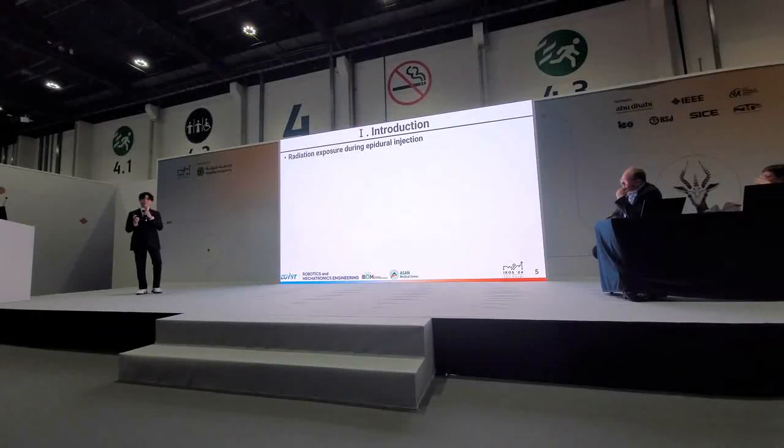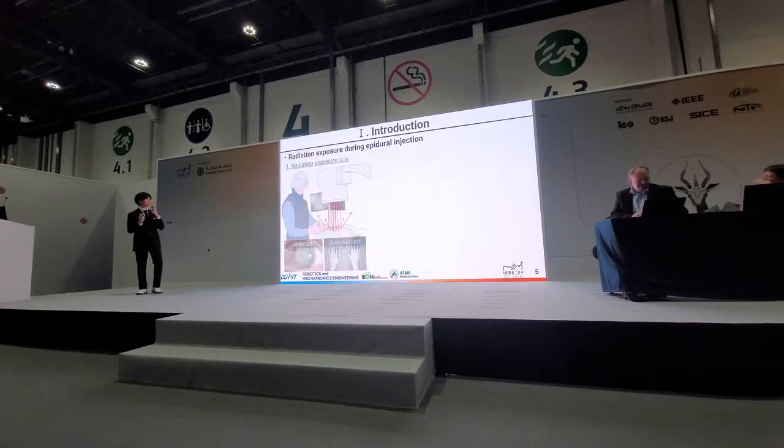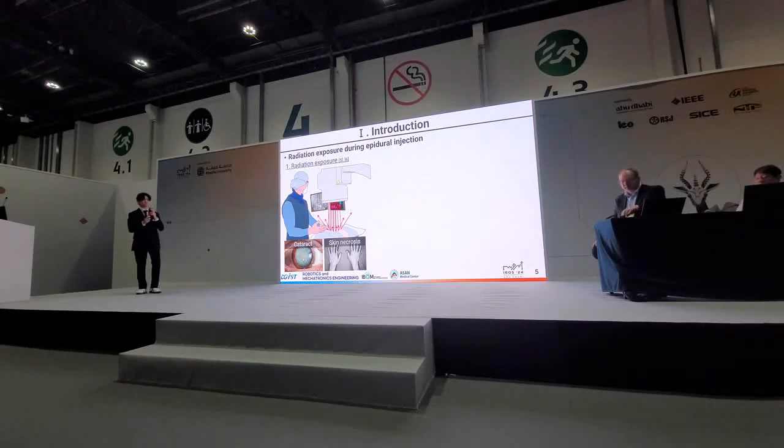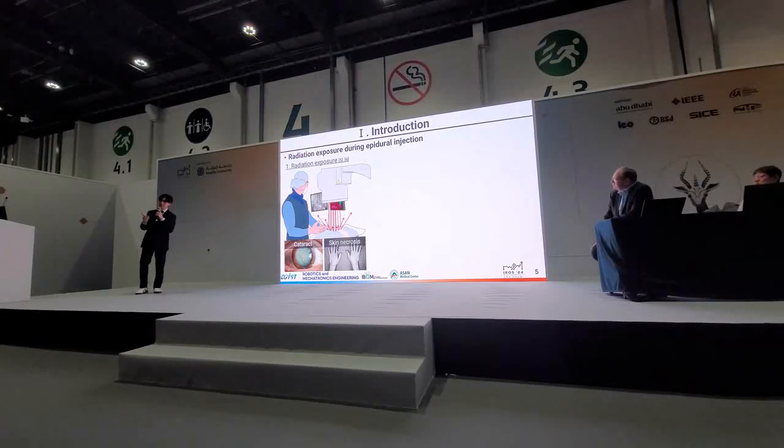However, performing the procedure in very close proximity to the X-ray, which emits radiation, poses a potential risk. In a general hospital, interventionalists perform an average of 4 procedure sessions per week. And each session lasts about 4 to 5 hours, meaning they are exposed to radiation for a significant amount of time.